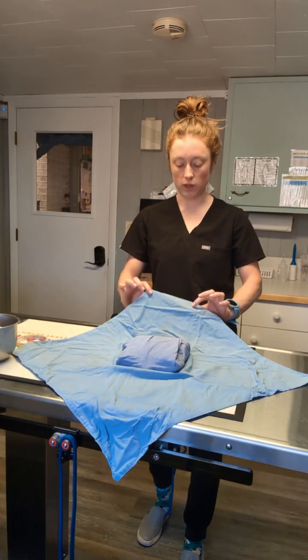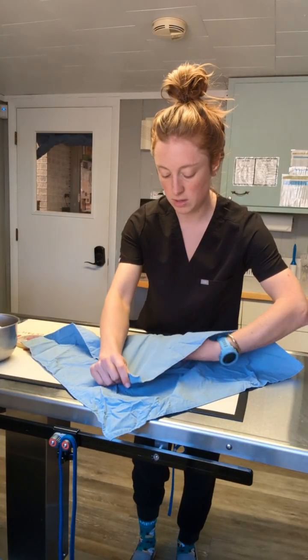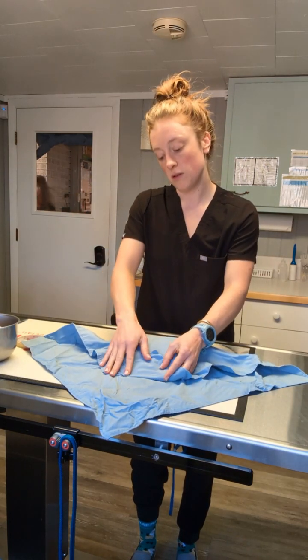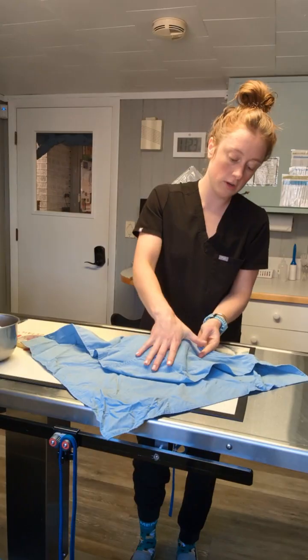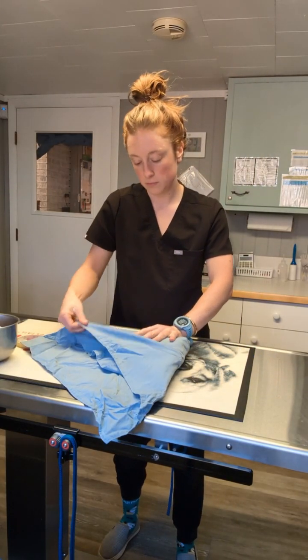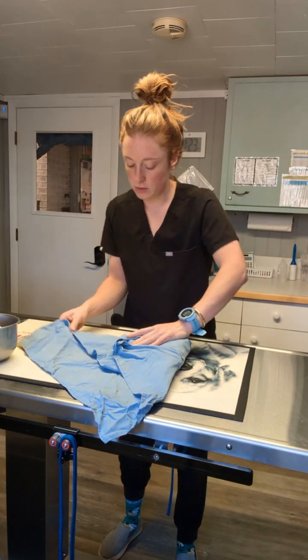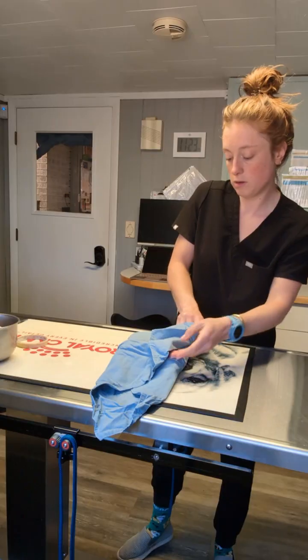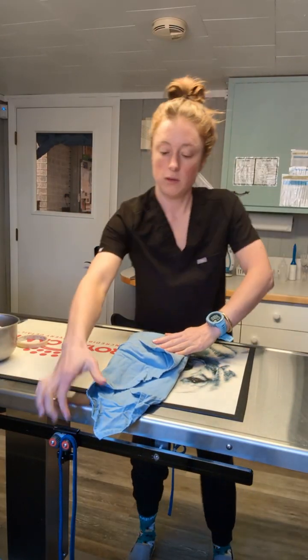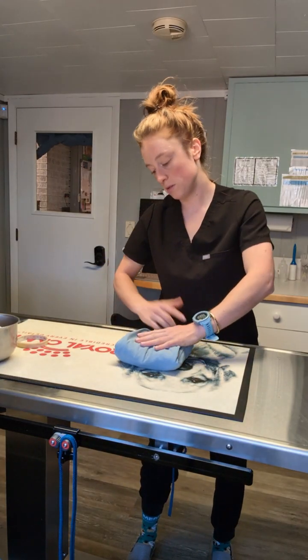And do the same thing with the outside layer. So starting with the side closest to me, fold it up, folding back one corner, left side, folding back a corner, right side, and the furthest side.